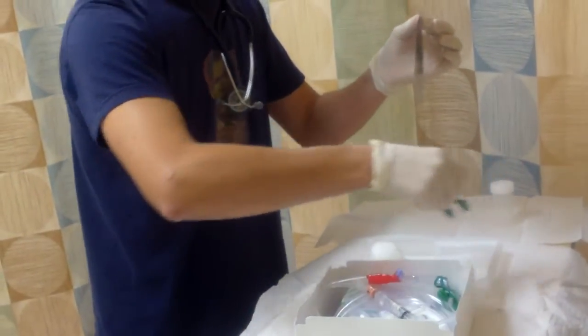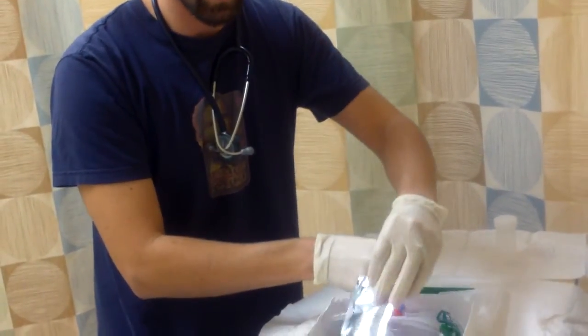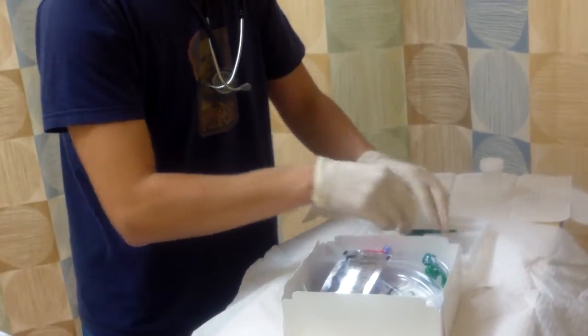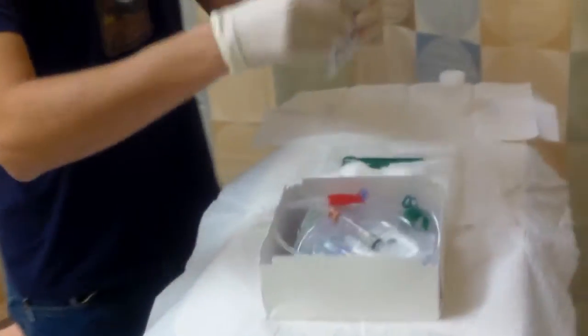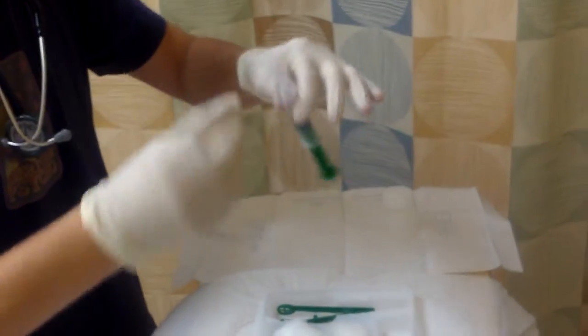Actually, I'm not going to open that quite yet, because I need to fluff my cotton balls. So I'm going to fluff. This is still sterile. This is not open. Fluff, fluff, fluff. So they're all fluffed. There we go. Open. I'm going to pour that over there. Okay, so that's done. Drop that. I still have my syringe here with my lubricant.